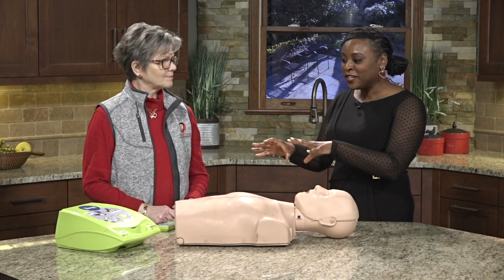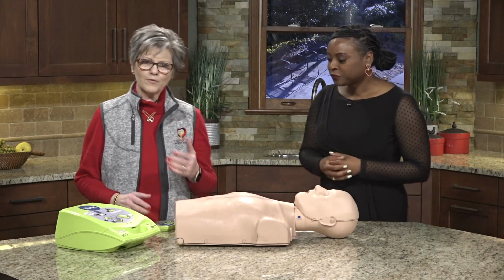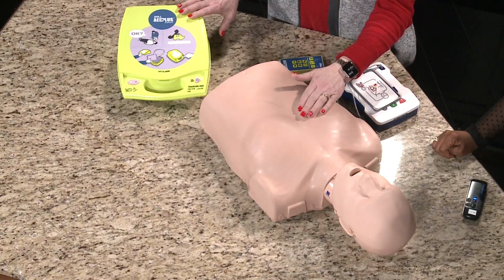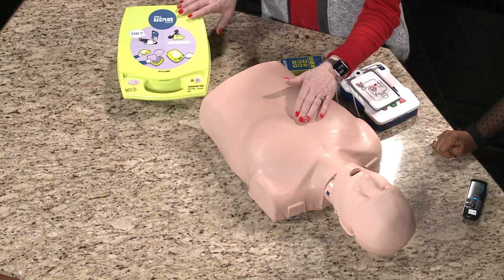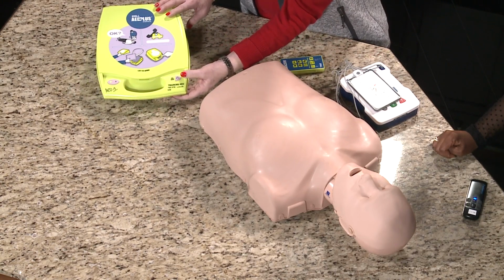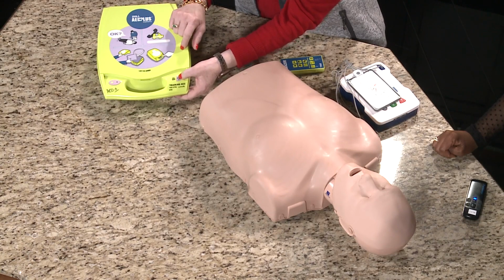Awesome. So you brought one here to our studio. Walk us through how it's used. Okay. So if you're the one bringing the AED up to the emergency, there's probably someone else still doing CPR and compressions. They're not going to stop while you put this AED on. So the first thing to do is to turn it on, and it'll have an on-off button, which will be very evident as to where it's at. So I'm going to turn this on, and it also says lift to open.